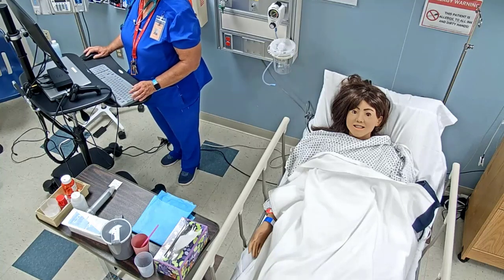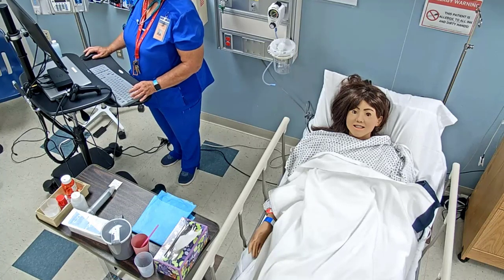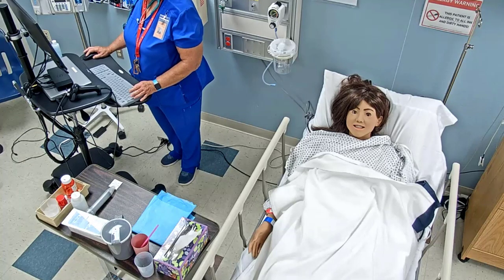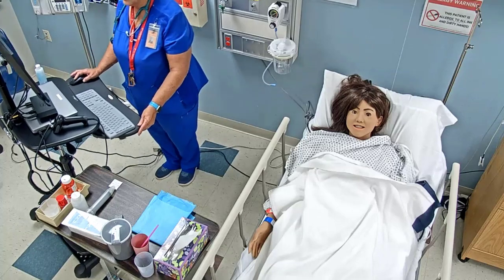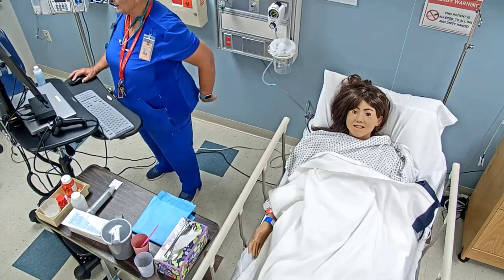And so I documented that one, and then I'm going to my Pepcid, put my initials on there so that I gave that. I'm going to go ahead and save that, showing that those meds were given, and they were given by the PEG meds there.